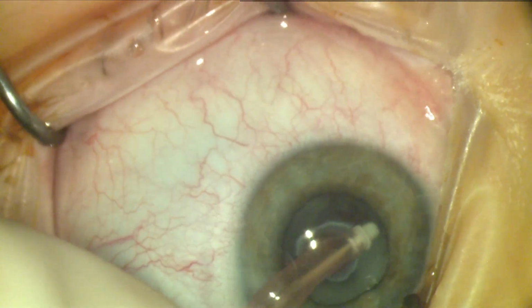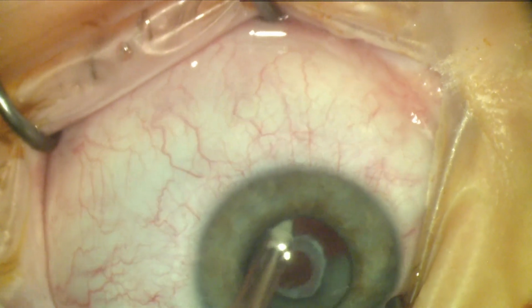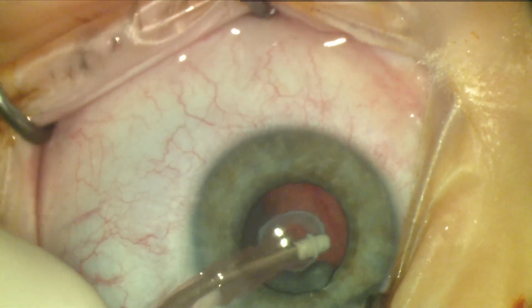After filling the anterior chamber with viscoelastic, an MVR blade is used to make a few cuts in the anterior capsule to access this material. After this is done, the irrigation aspiration device is used to gently remove the material.